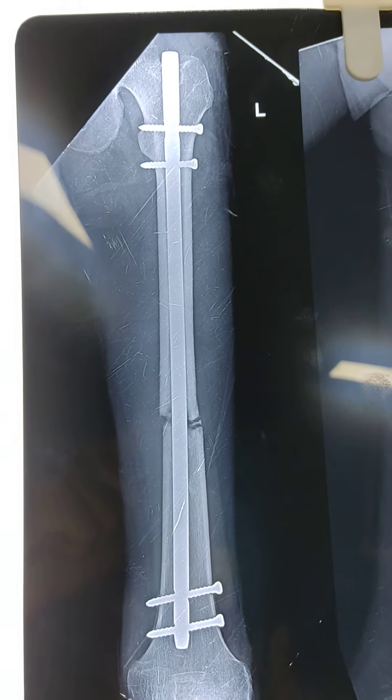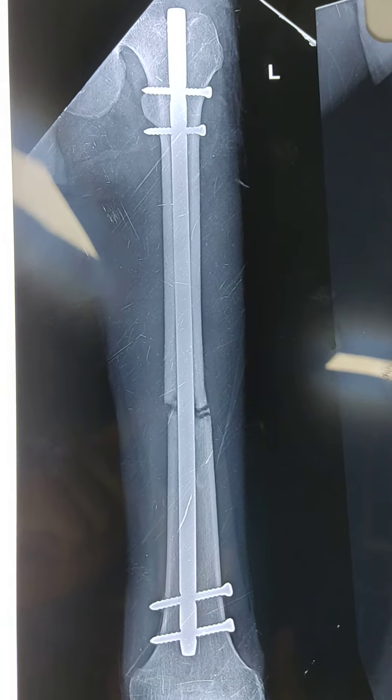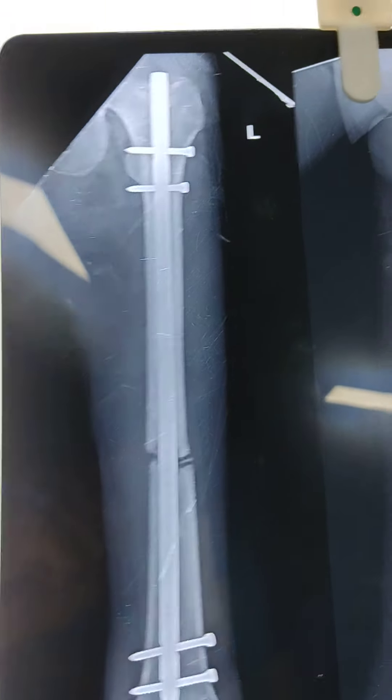Hi friends, this is a patient of femur nailing operated around 6 weeks back. This is the present x-ray.